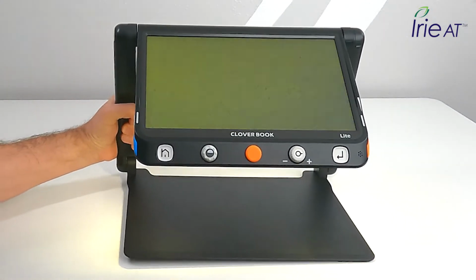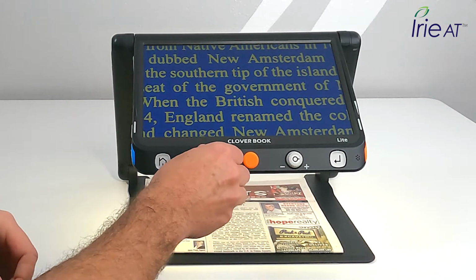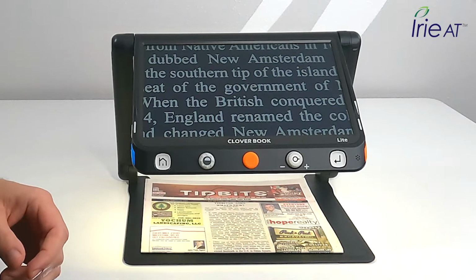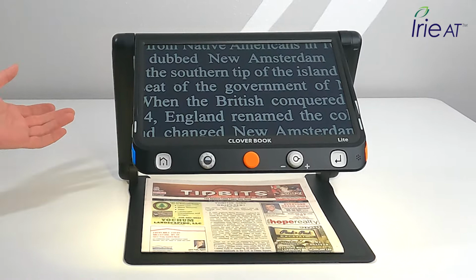I'll get that on. Green light comes on, and the device is up and ready to go. I'm going to turn it to a contrast that I like a little bit better. Okay, so let's take a look at some of the basic features.